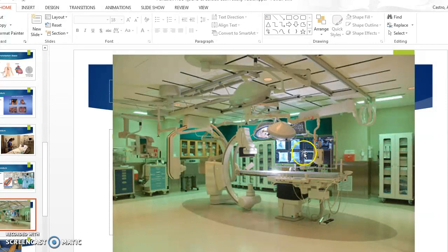We have our contrast dye injector. These are controls to move the table here. This is our fluoroscopy camera, and it rotates from left to right and can give us different views, and it looks like they even have one going the other way too, probably to help with vascular procedures. And then all this equipment up here is so that you can move the camera. You can move it on the side. This big part swings around on the side. All these attachments, you can bring it down however you need it.